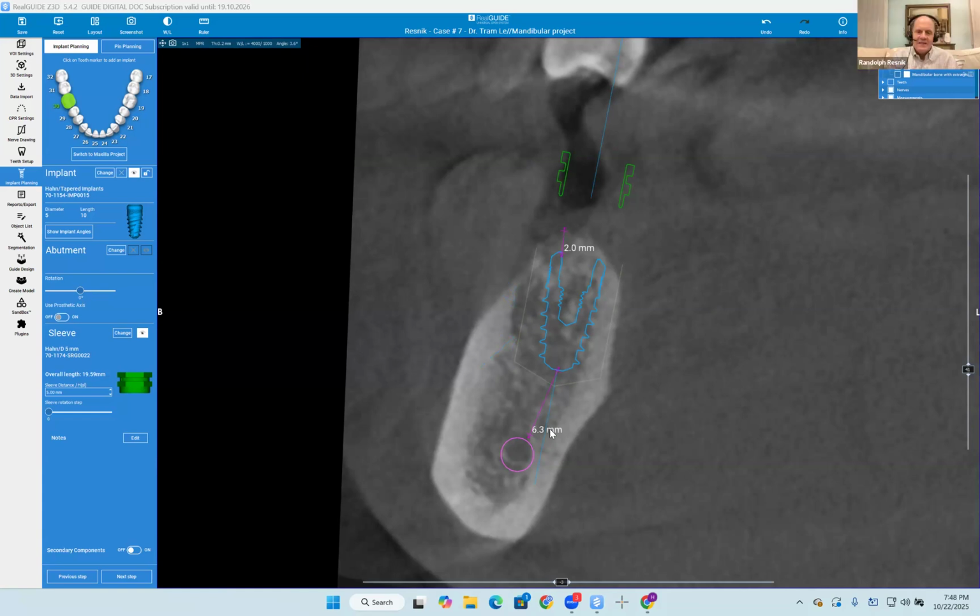So where he has it, do you see where he positioned the implant? It's going right into the lingual cusp of the maxilla. So this position is perfect. If you place the implant in this position, what I want you to do is make a little envelope flap, extend it a little bit more onto the buccal, and see if you have a little bit of a defect there.